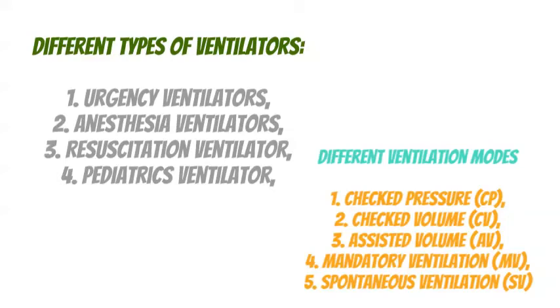In many cases, mandatory ventilation mode is first necessary to treat the patient, and as the patient's condition improves, spontaneous ventilation can be introduced. Spontaneous ventilation is an important phase in providing respiratory therapy to a recovering pulmonary patient: weaning the patient from the respirator. As the patient recovers and gains the ability to breathe independently, the ventilator must allow the patient to initiate a breath and control the breath rate, flow rate, and tidal volume.